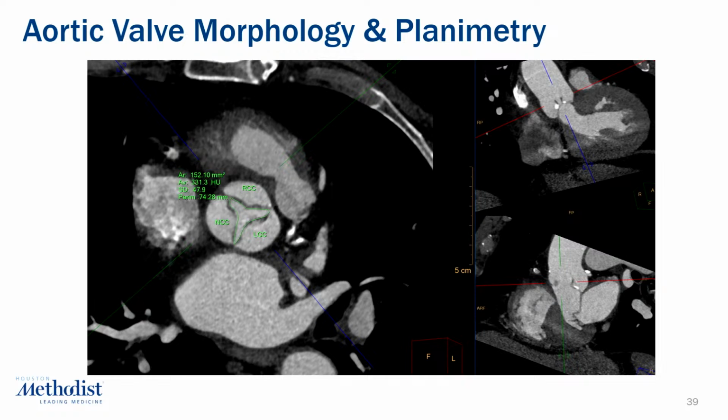Aortic valve area, as we know, by echo can be underestimated, especially if you're underestimating the LVOT, right? Or if the Doppler is not coaxial with the LVOT, that can also result in underestimation of gradient. So just something to keep in mind. Geometric area is larger than effective area. Yes, usually it's about, I think, 0.2 or 0.3 difference. So it shouldn't be too off if your Doppler measurements are accurate. Sometimes you're lucky enough to have MRI measurements too, so you can do correlations.